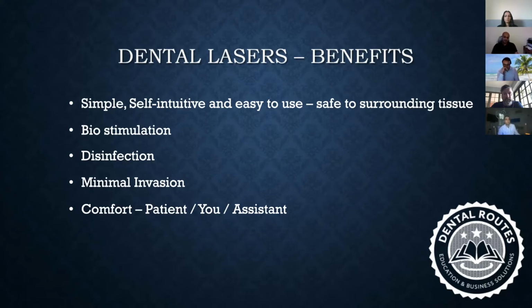And because it is simple to use, I'll also explain how it is so safe for you to use, especially on the structures. Because we are so used to using drills and scalpels, and we are worried and stressed every time about the amount of damage we may do to the structures around us. While you're using a drill, you have two people stretching the tongue on one side and the cheek on the other side because you don't want to ever touch the tongue or the cheek. When you are trying to use a scalpel, you're worried about lingual nerve damage and the tissues around getting damaged. All these issues can be much better dealt with when you're smartly using laser for your day-to-day dentistry.